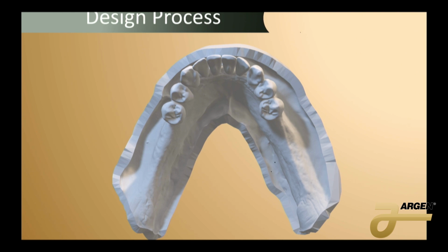So if we have surveyed it and we have found that we have nice mesial undercuts over here, this is exactly how I go into a case every time in Paint. I just draw all over it and I keep that image before I go and click the buttons and design this. So we have a nice mesial undercut, right? That means to get that fulcrum, I want the clasp tip, the edentulous space on the same side, right? So I'm going to go with a mesial rest here.